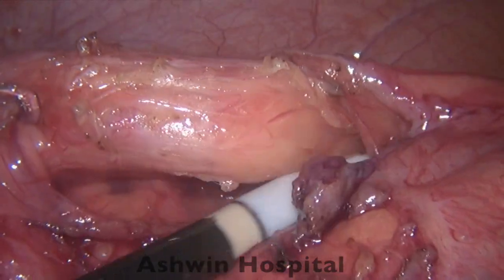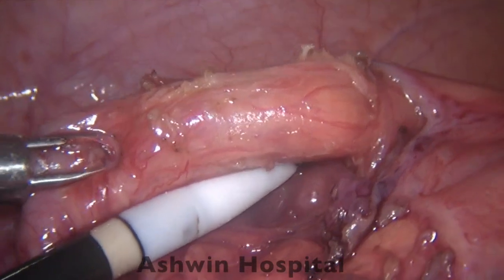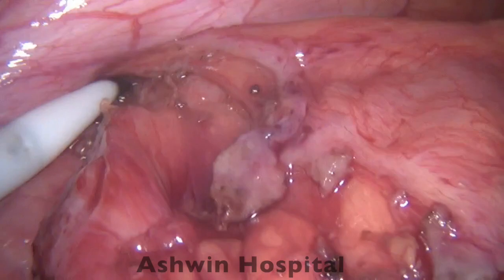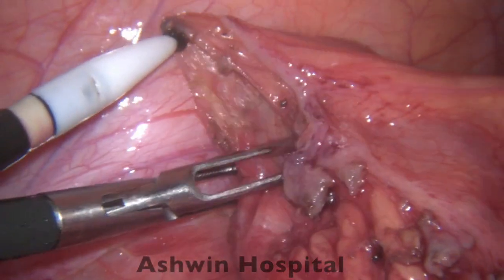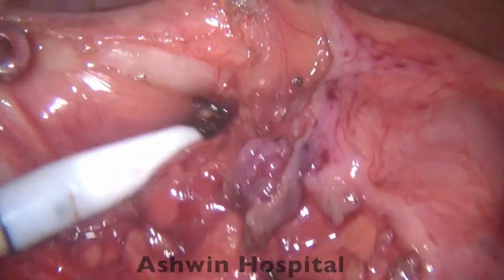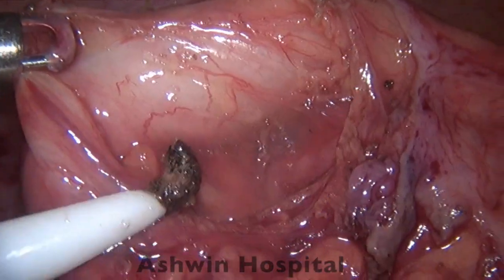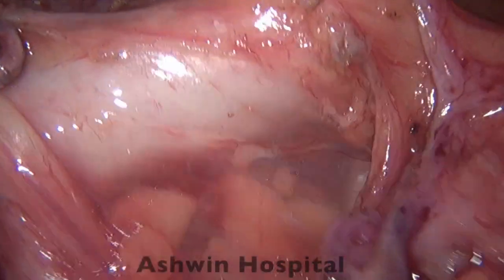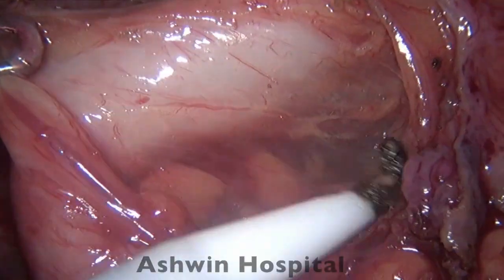We release all attachments all around — only if done all around can we appreciate the structure well. The tip of the appendix is now coming into our dissection field and we grasp it a little more distally, giving adequate traction so the tip can be appreciated very well. Whenever there is a fibrotic strand, we use a short burst of cautery followed by a combination of blunt dissection to open up the planes in a meticulous manner.